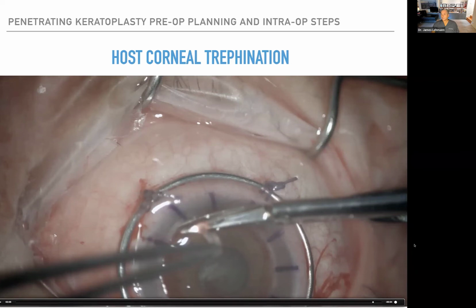Dr. Zarwan asks how to avoid cutting the iris if there's anterior synechiae. You may have to cut the iris. Sometimes it's adherent to the back of the recipient and you have to cut it. So you just try to do it as carefully as possible.